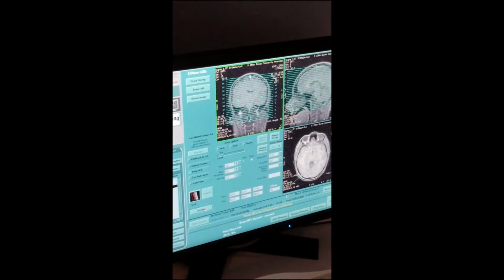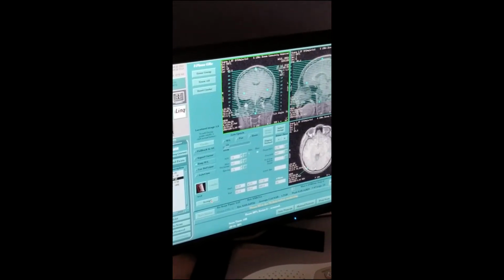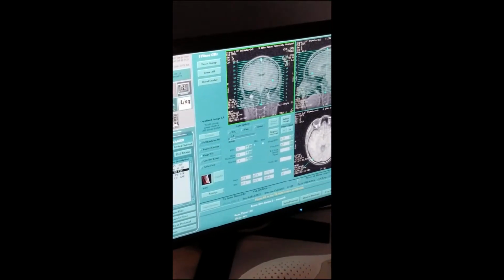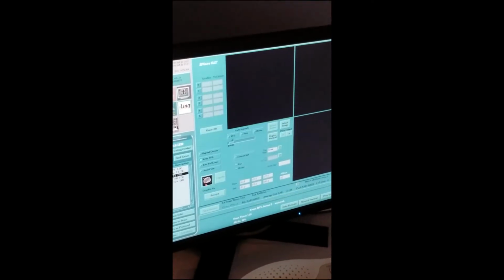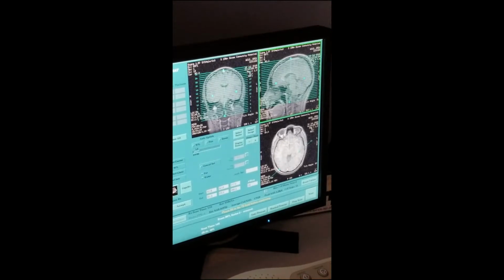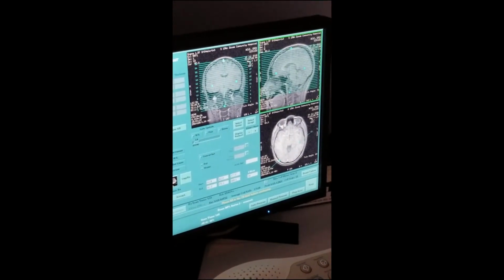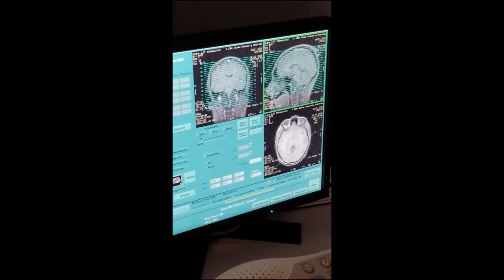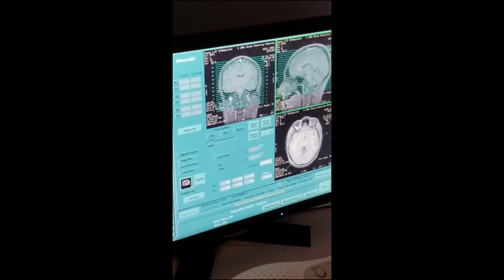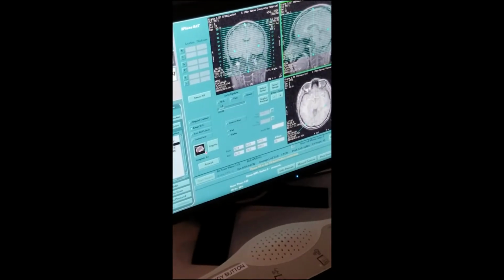Well, we've got to put a sat band on. The brain needs a sat band. Saturation. It minimizes the signal, not noise, but motion. The motion of the blood, right? Yes, minimize motion of CSF and blood.